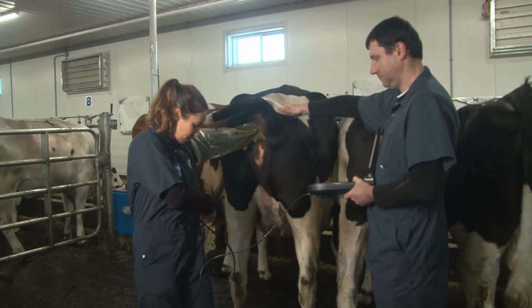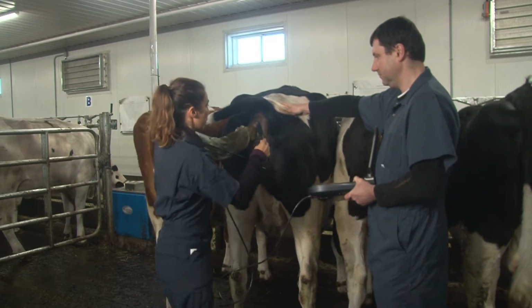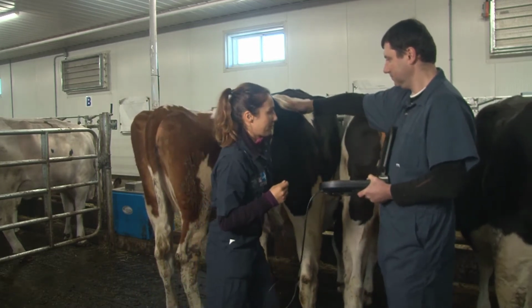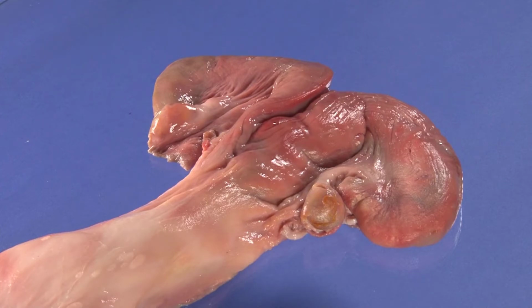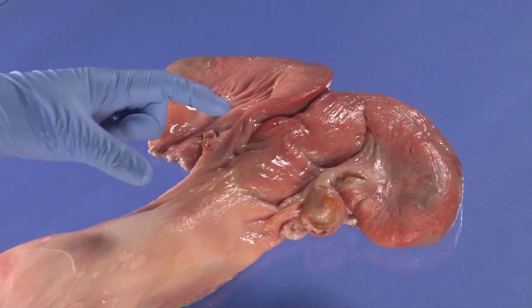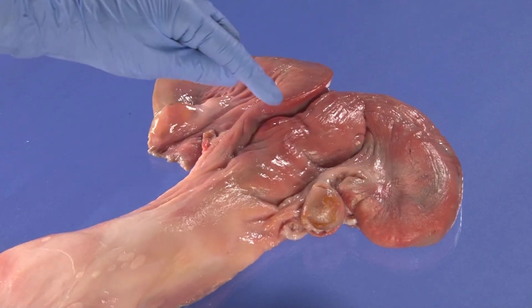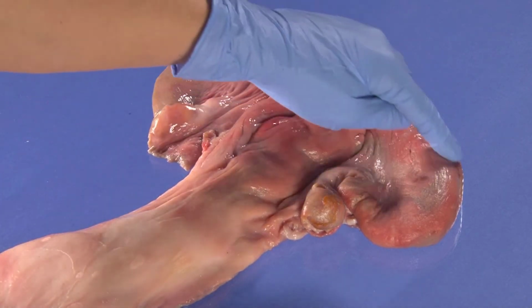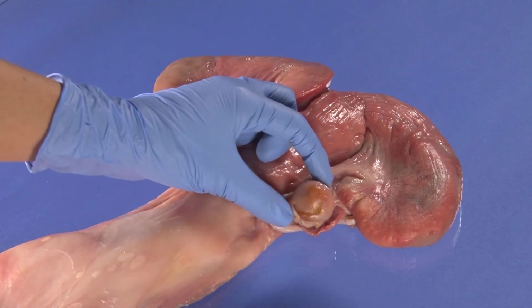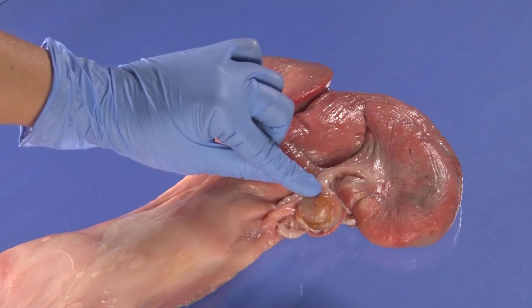As for all transrectal examinations, you will first need to empty the rectum and retract the uterus. Introduce the linear probe and identify the presence of one or more corpus luteum with the normal mode. Here, we will use a uterus ex vivo to demonstrate the manipulations during the Doppler examination. You can see here the interior vagina, the cervix, the body of the uterus, the horns, and the ovaries. On the right ovary, you can see a CL.